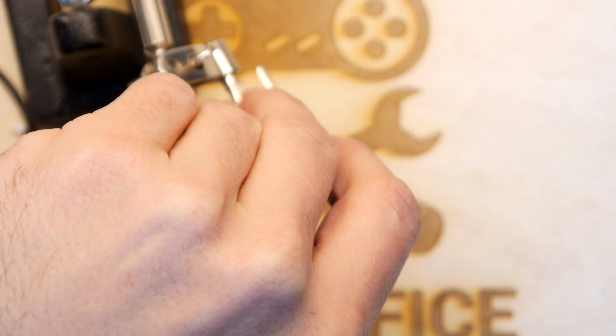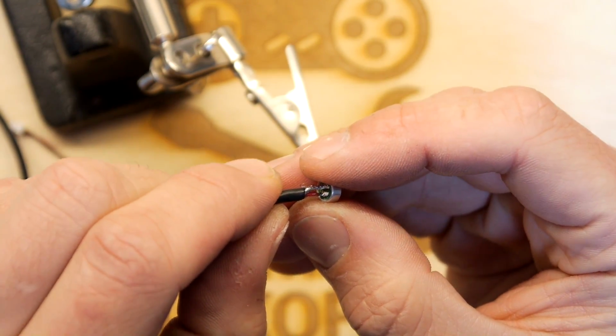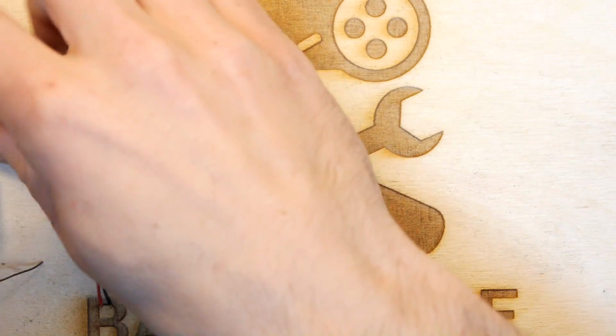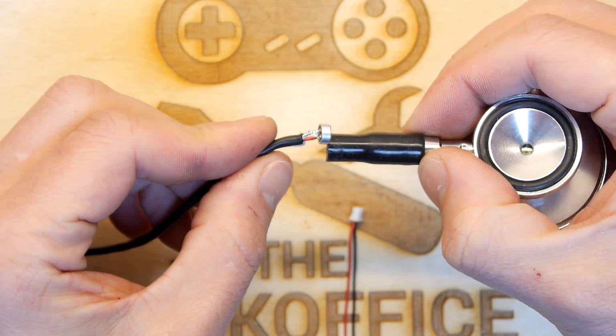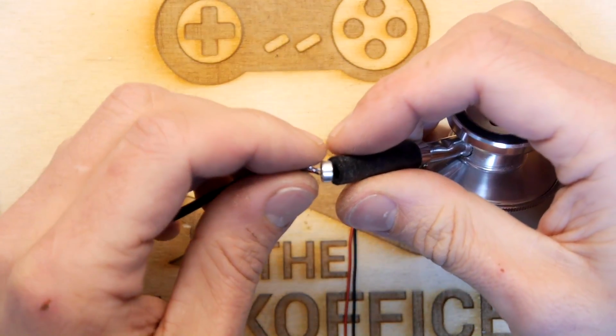There we go. Try not to hold your soldering iron on there too long, because you might just melt the innards of that. You've got to be careful. It is a little circuit board in there sometimes with a little transistor. Very teeny tiny. But that's good. So you can see now, all I want to do is push that in there. And then we'll heat shrink over that for some strain relief.